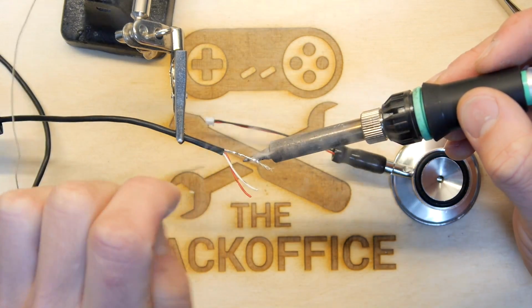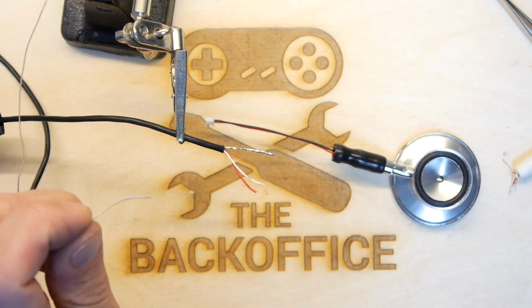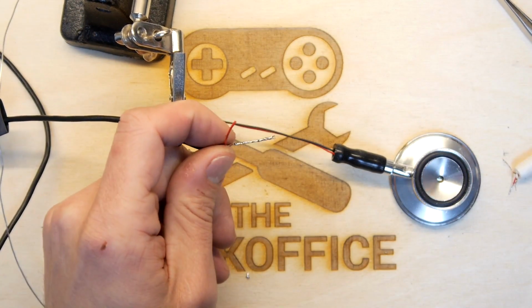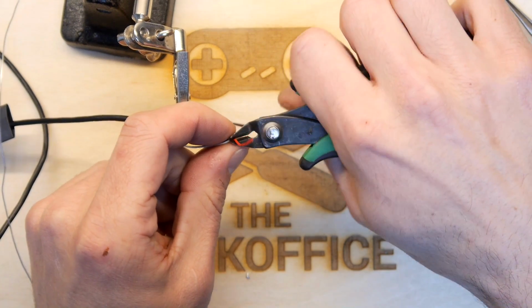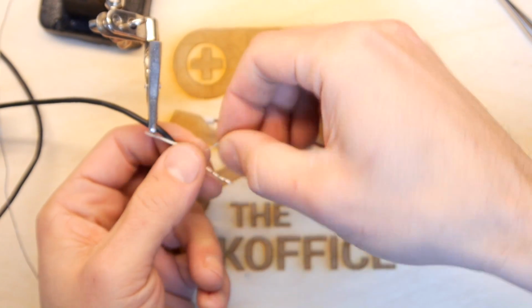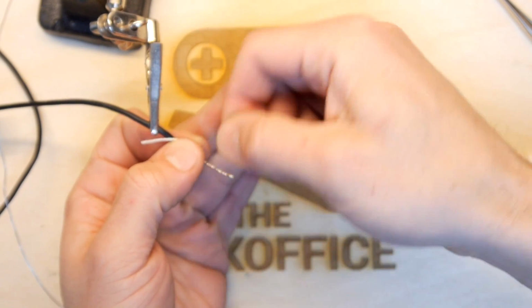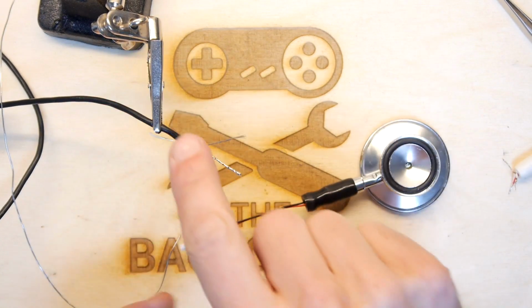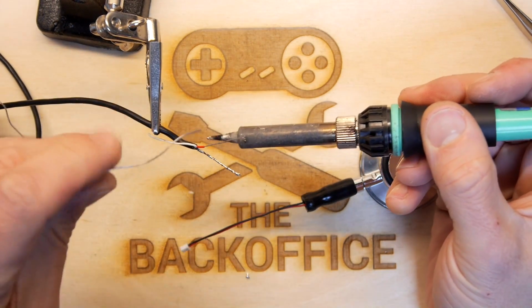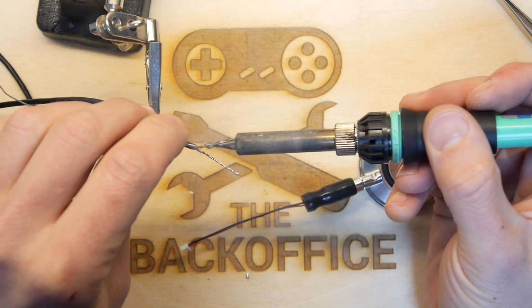Tinning that common, tinning it right up. We're going to trim it down, but I'm going to trim right to the base. There we go. Perfect. Absolutely perfect. I think red's a nice colour, so I'm going to strip the red and tin that. Unless, of course, there we go. I thought I might overdo that and end up ruining the red. In that case, I would have gone for the white. So we just need to tin that one. Oh, pardon me. Bit of a frog in the throat today. Tinned all the way. And the white we'll just leave alone.